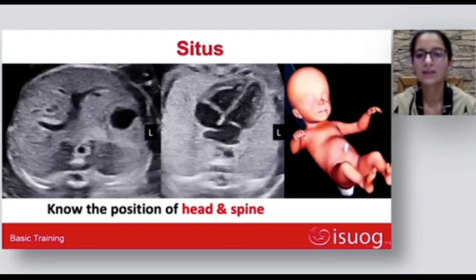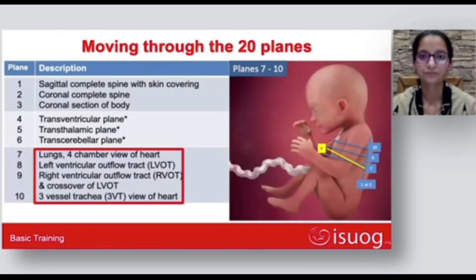So correspondingly in this image, fetal left is on the right side here, and we can see the cardiac apex directed towards the fetal left, as well as the stomach on the fetal left, indicating that the baby has situs solitus. Now, where do the rest of the planes of the heart lie?